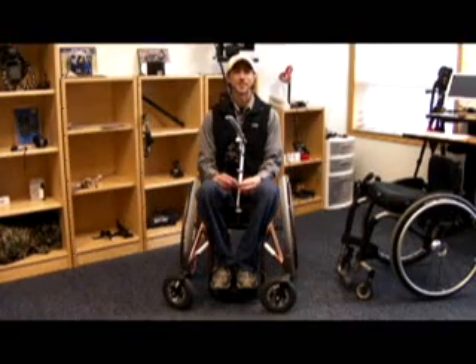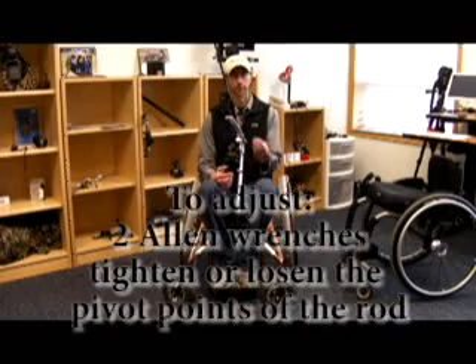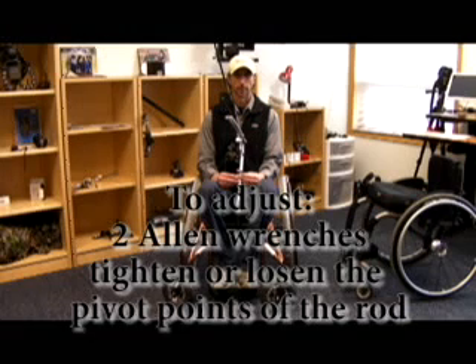Once the rod is installed, you are ready to adjust. You only need two allen wrenches to adjust this rod — a 3/16ths and a 7/32nds.